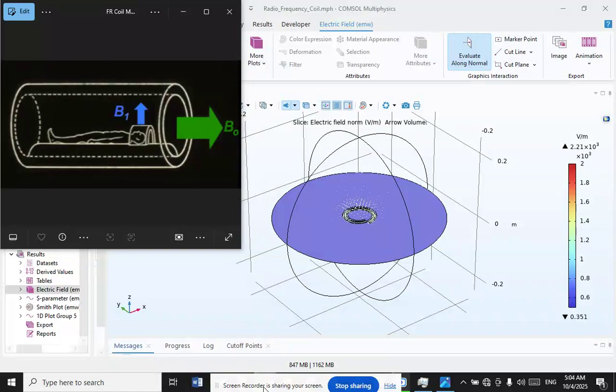Radiofrequency coils are an essential MRI hardware component. They directly impact the spatial and temporal resolution, sensitivity, and uniformity in MRI. Advances in RF hardware have resulted in a variety of designs optimized for specific clinical applications.